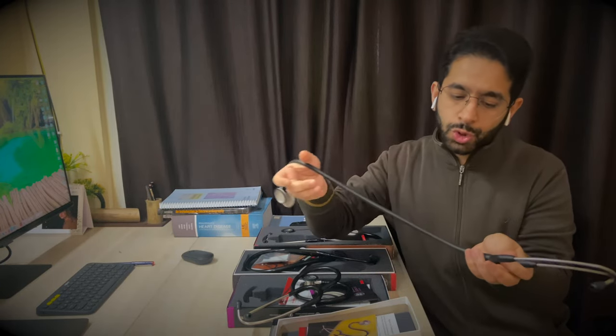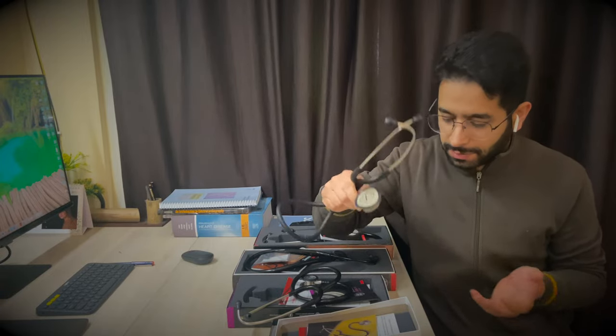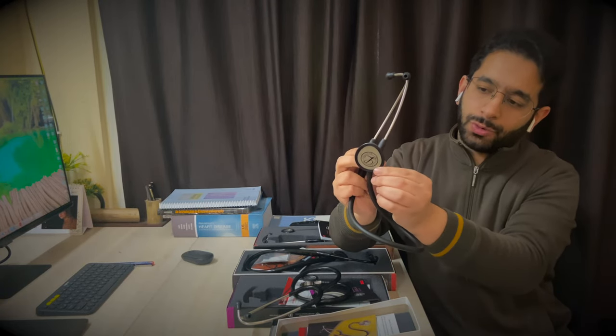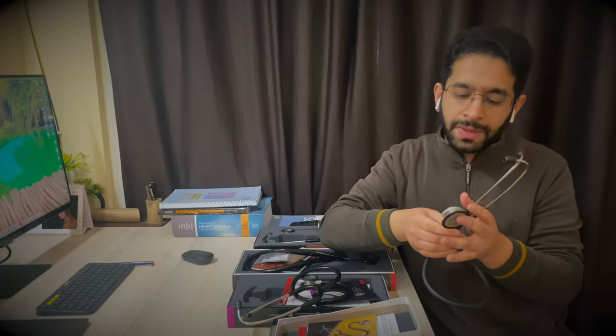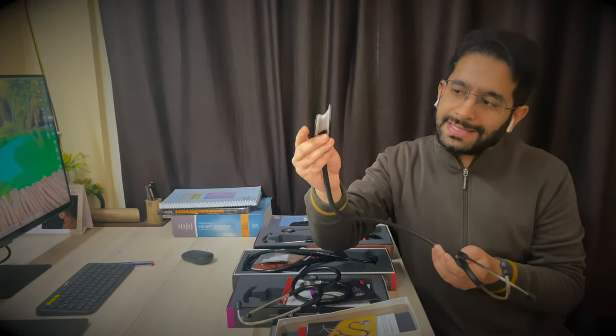Starting with the lightweight stethoscope: it has a chest piece, tubing, air tubings, and earbuds. It's the lightest of all, around 120–130 grams. Its diaphragm is almost a teardrop shape, designed so the front part slides underneath a blood pressure cuff. It is ideally recommended for physicians or nurse practitioners to measure blood pressure and perform basic physical exams, or record gross abnormalities of cardiac and breath sounds.